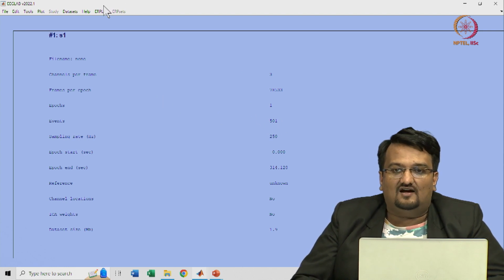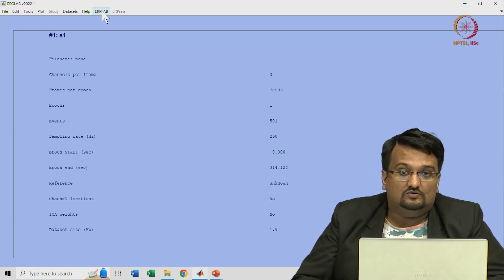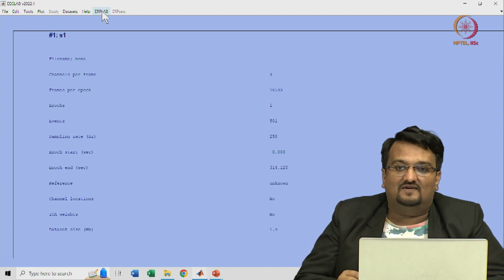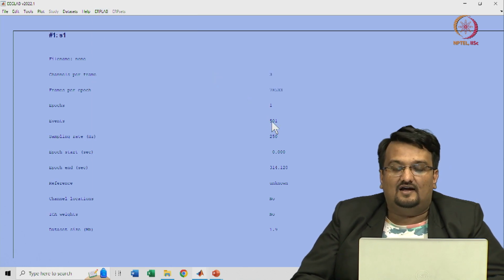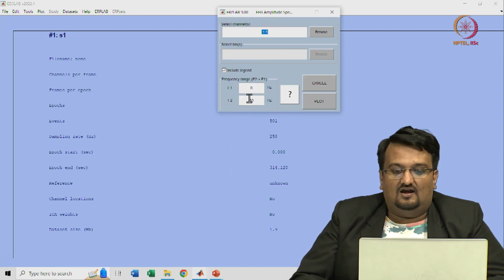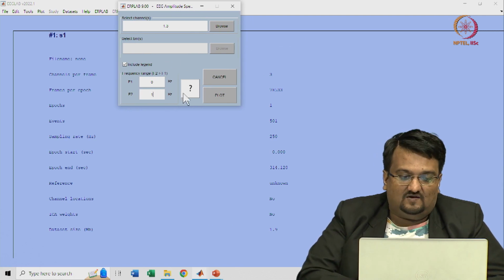Mostly this data is taken in a constrained environment with minimal electrical interference. However, there will be some line interference, and the EEG that has been recorded is of microvolt magnitude. That's why it is likely to be influenced or deteriorated by power line interference. So we have to first check whether there is any power line interference or not. Using ERPLAB you can plot an amplitude spectrum to get that idea. Now we have 3 data channels, right? So we can check all 3 data channels, and our sampling rate is around 250. So we can put 120 here.